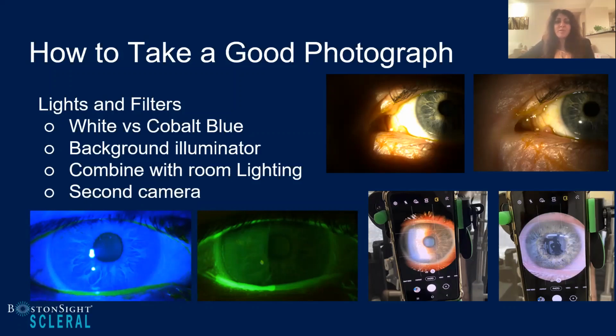In these two pictures up here, the photograph on the left has the slit lamp light shone right on this papilloma, and you can barely see it. One of the things that came with our slit lamp mounted camera is a backlight illuminator. This is an additional light that attaches to our slit lamp that we can bring off to the side and shine onto the cornea. You can see by using that background illuminator what a difference in picture quality it has given us, where we can see that papilloma so much better.